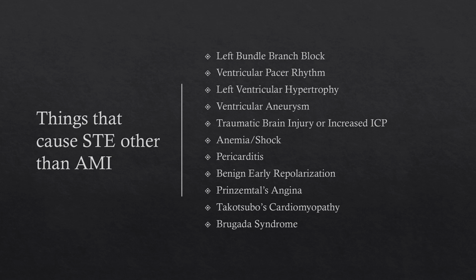And of course, with some of them or most of them, your physical exam and other diagnostics can help clue you in. Case in point being like Takotsubo cardiomyopathy or Brugada syndrome, anemia and shock. If your patient's bleeding to death and shows ST elevation, it's probably not a STEMI, it's probably hemorrhage. So we'll kind of intertwine those throughout this lecture as we try to improve our ability to use that ECG to diagnose.